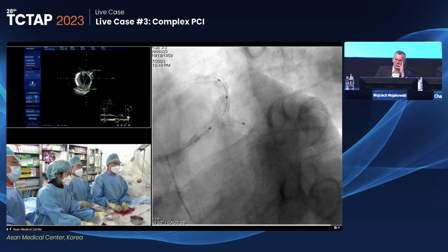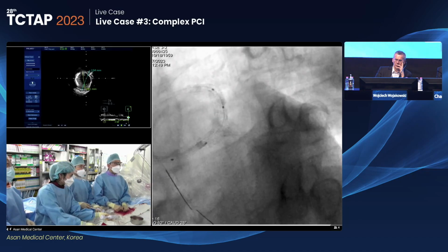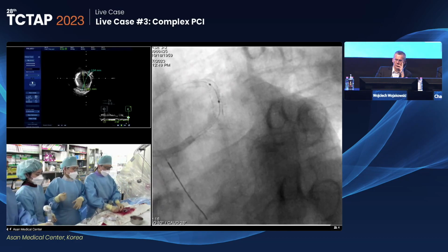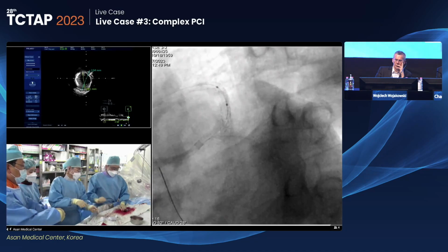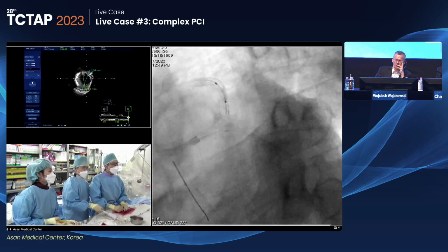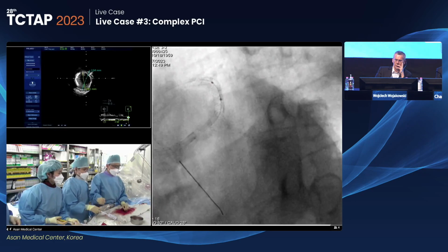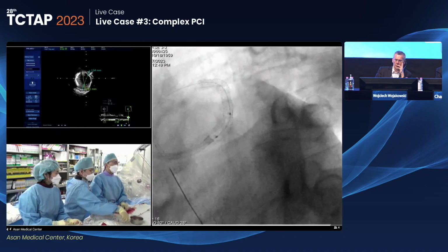There is some haziness at the outside of the circ stent. Okay. Let's see. Test. So check the flow. Test. Then remove the circumflex wire, and we'll do nominal.